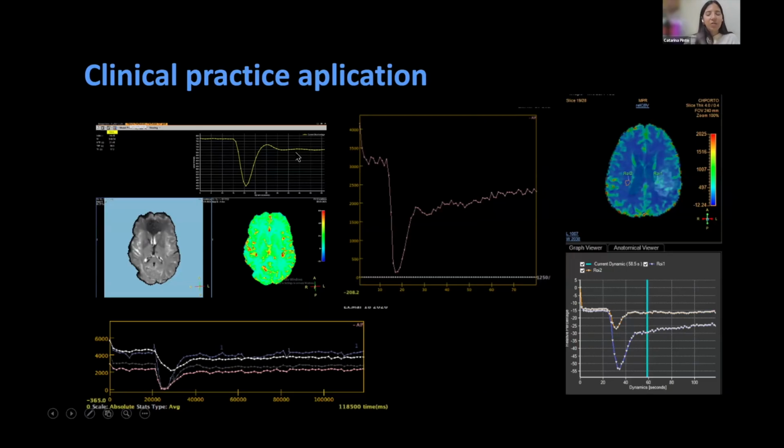This is the mean signal of a slice, and we can see what we previously talked about regarding the curve. So we have this drop of the signal intensity, and then the recovery that is not complete, but it is very high, as opposed to the regions with the tumor, where you can see the drop of the signal and then a mild recovery.